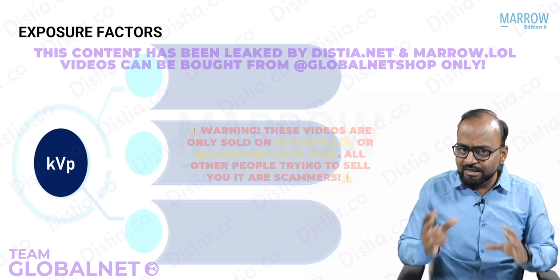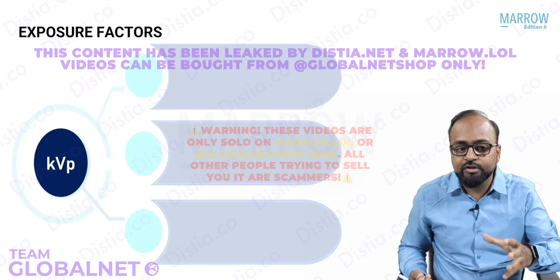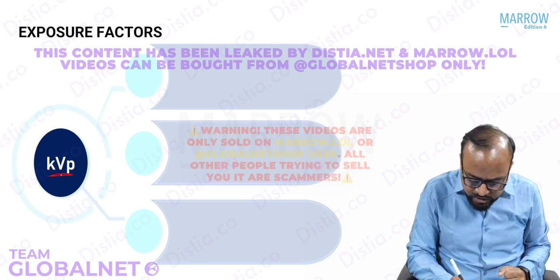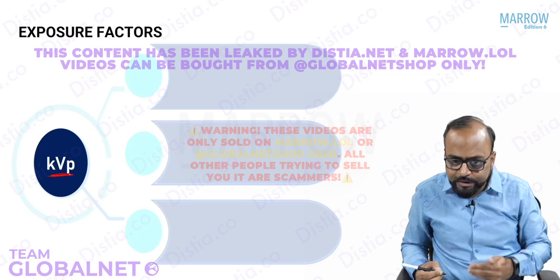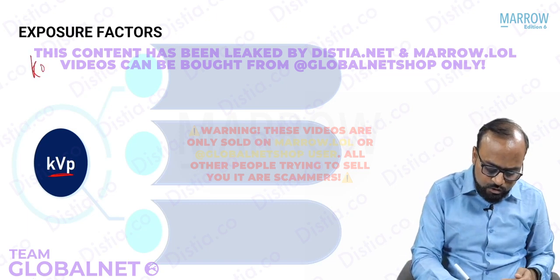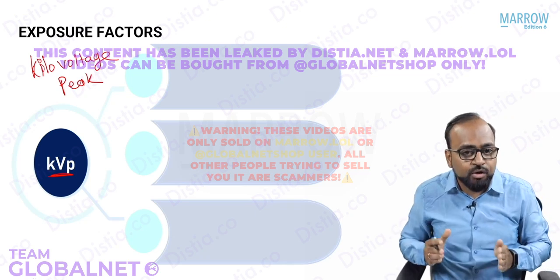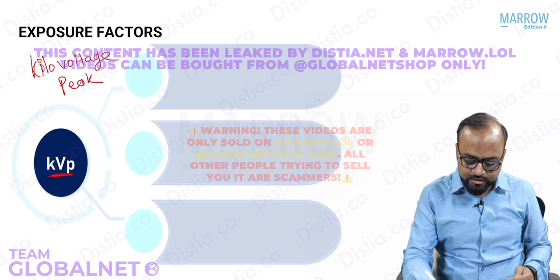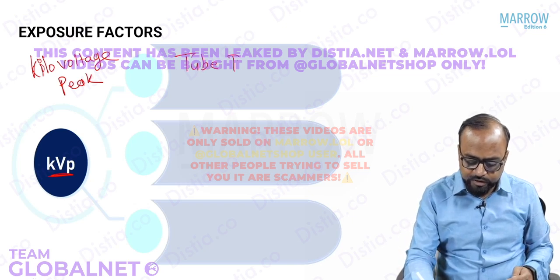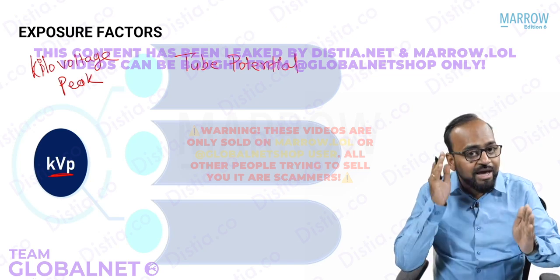Then, whenever we do an X-ray, on the X-ray unit or console, there are certain exposure factor knobs that we are supposed to change. Let us consider these exposure factors. These are called KVP and MAS. What is KVP? KVP stands for kilo voltage peak. Kilo voltage peak means what? It is the potential difference which is applied across the X-ray tube. So it is the tube potential difference across the anode and cathode within the X-ray tube.